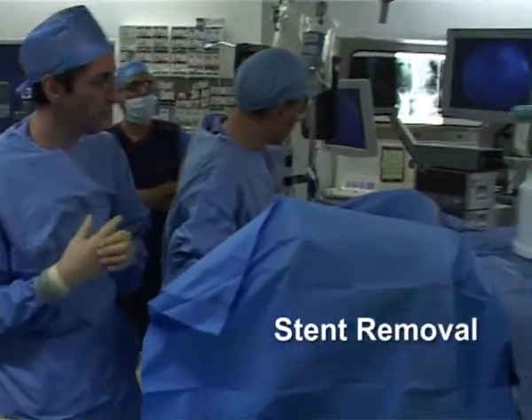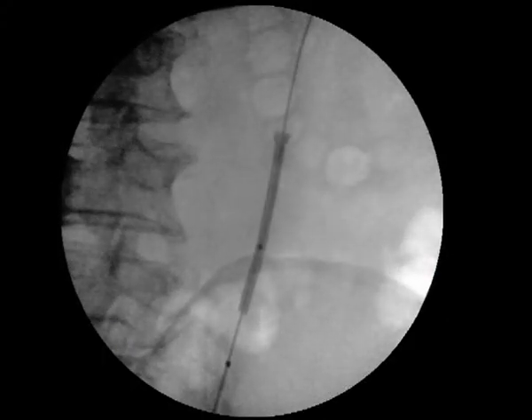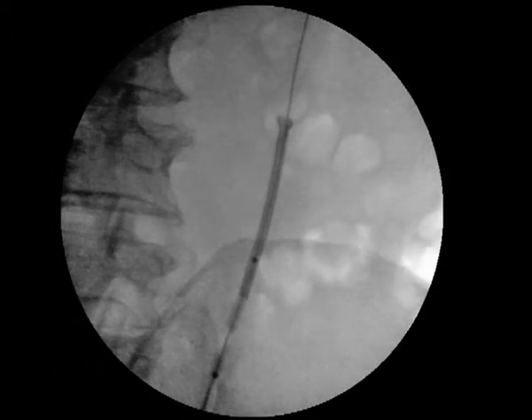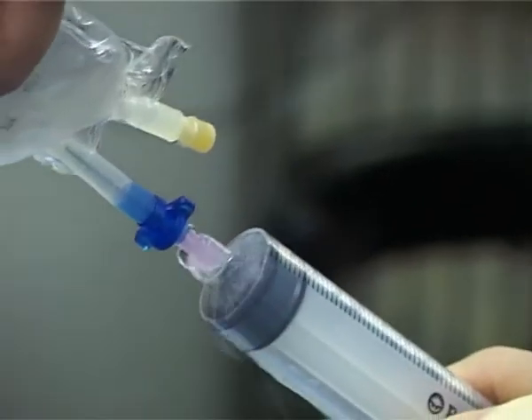It may become necessary to remove a stent. As before, a ureteric balloon catheter is halfway inserted into the stent over a guide wire and gently inflated. Refrigerator cold water is ready and loaded into a syringe.